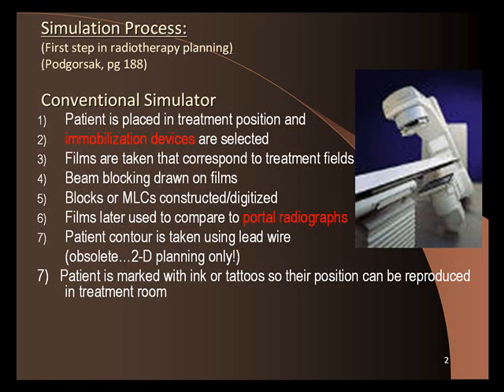And what the image intensifier down here does is take the X-rays and convert them to light with a phosphor. The X-rays get converted to light, and then there's a little camera at the back, and that camera talks to a monitor. And that monitor is in the control room. So the physician, have you guys heard of fluoroscopy? Yes.